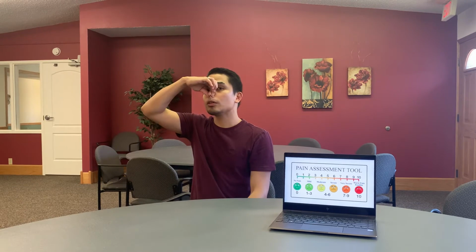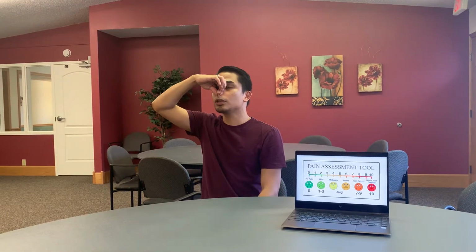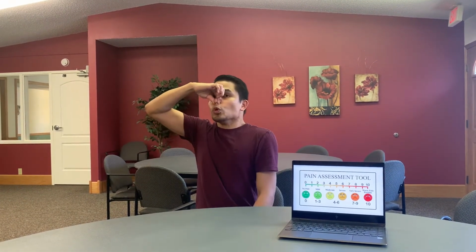First of all, we tell them to do normal breathing, using this demonstration, at least 3 to 5 normal breaths. By looking at their chest rise, or at the graph, after the exhalation period of the patient, we tell them to take a deep breath in. We also tell them, when you take a deep breath in, assume that you're drinking soda using a straw, sipping it, and take a deep breath in like that.